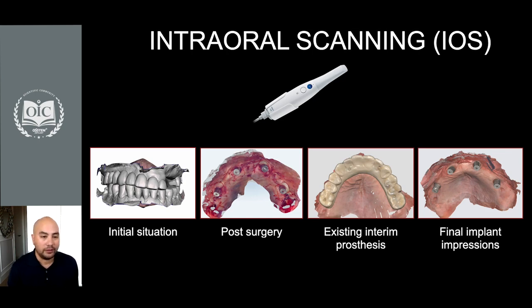We're not sure yet whether it's reliable for post-surgery scenarios when we place the implants and the scan bodies. As you can imagine, it's very challenging capturing a residual ridge post-surgery because of the blood and also the absence of any anatomical landmarks.